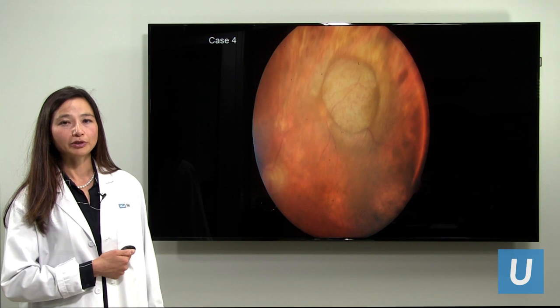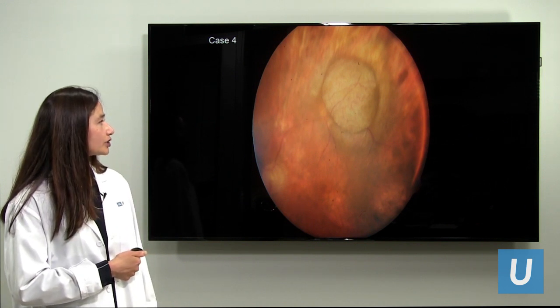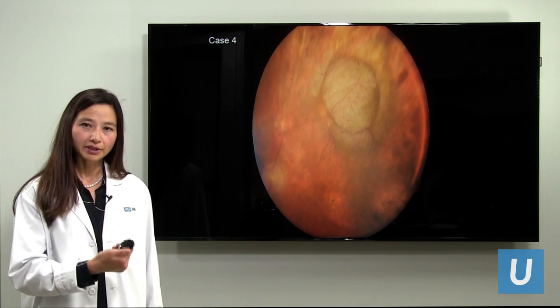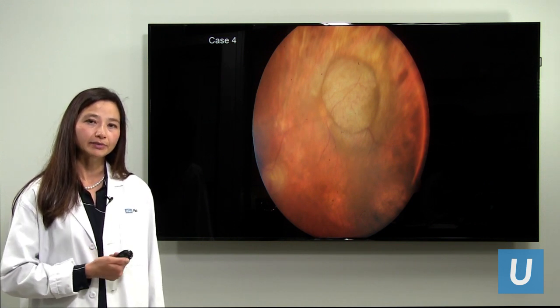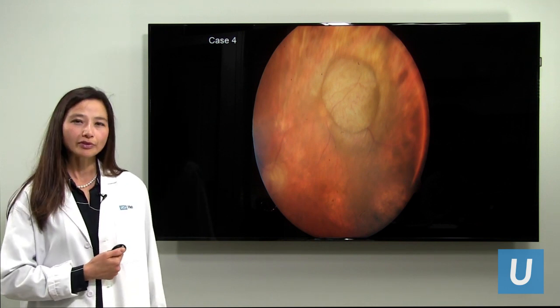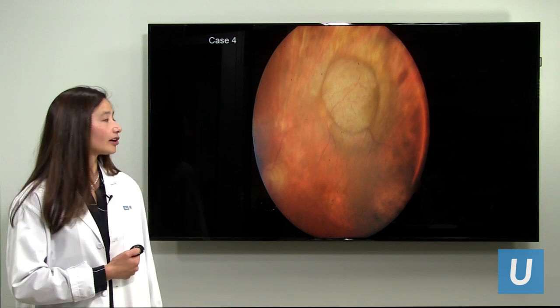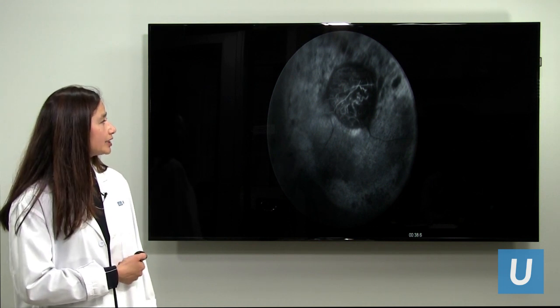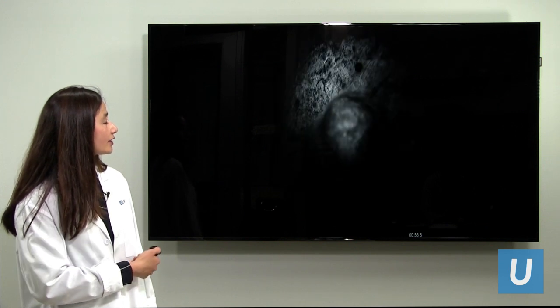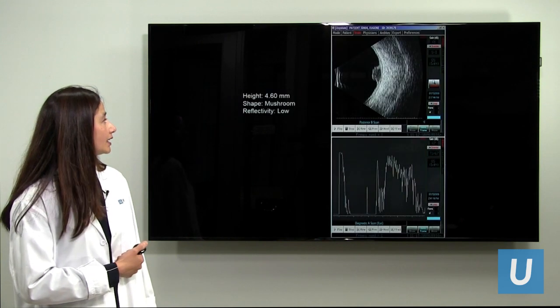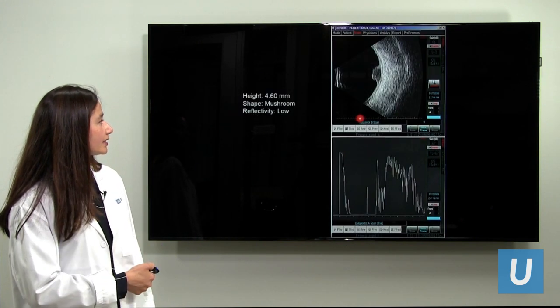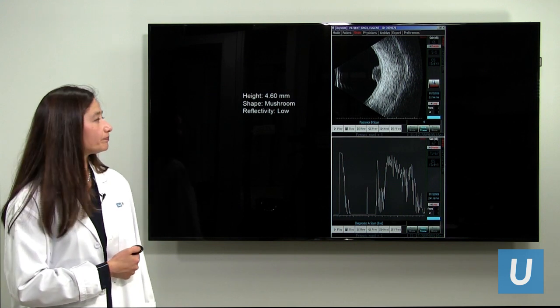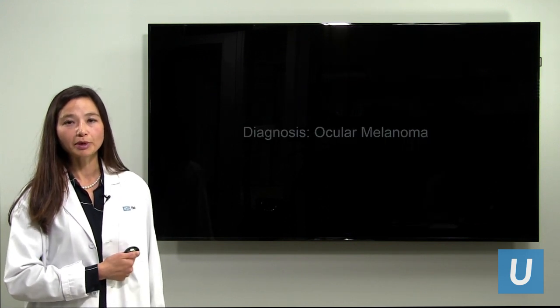In the last case, there is an unusual yellow lesion on the retina. The patient had a hemorrhage in the eye and the previous doctor performed surgery to clear the blood, finding this small yellow mass. However, the mass did not resolve — in fact, it seemed to get a little larger. Fluorescein angiography shows its own circulation with abnormal vessels leaking, and there is intense staining and activity around the lesion. Ultrasound reveals a mushroom configuration with a cap, which is very characteristic of an ocular melanoma. Ocular melanoma was also diagnosed in this individual.